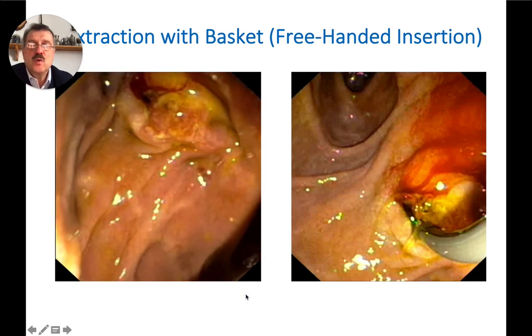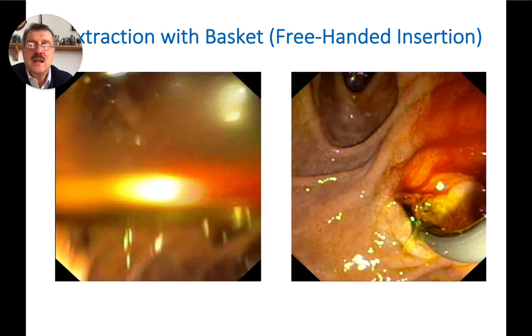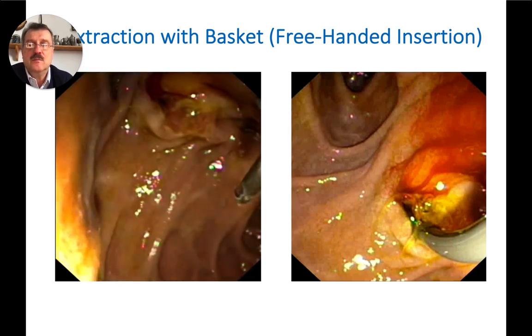Now I'm showing you examples of free-handed basket extraction of stone.